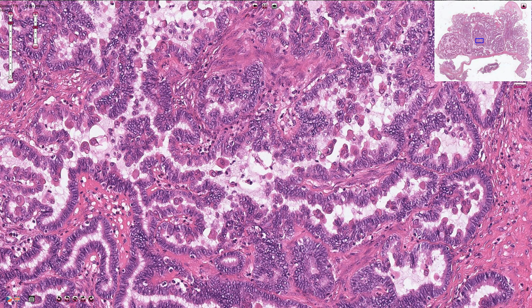Based on the histological appearance we can differentiate two types of serous borderline tumor: the conventional variant and the micropapillary variant. This is an example of the conventional type borderline serous tumor. The papillary structures are quite broad and short, unlike in the micropapillary variant which is associated with thin, long papillary structures.